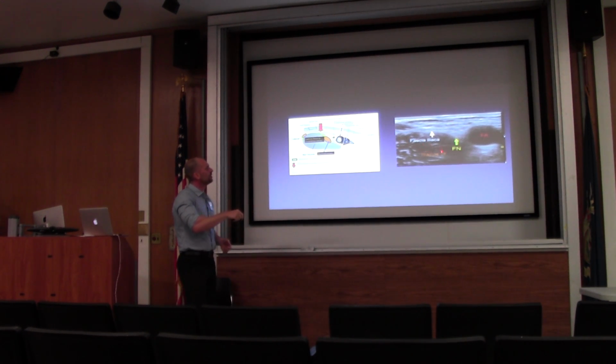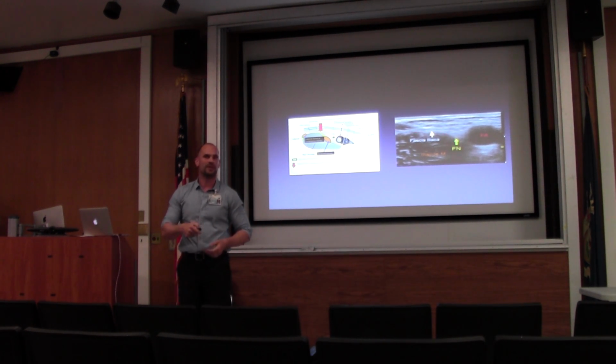And so the lateral bundle is going to be your iliopsoas muscle. And just superficial, you're going to see a little fine, bright white line. That's going to be your fascia iliaca.